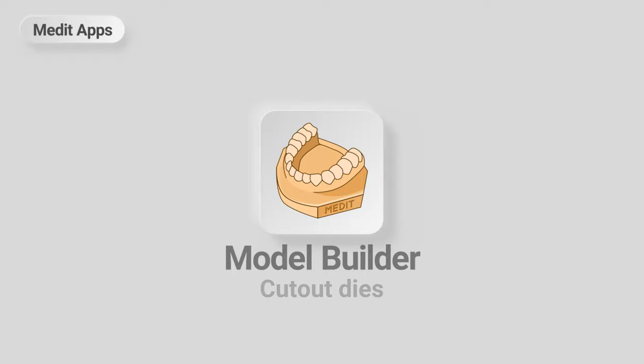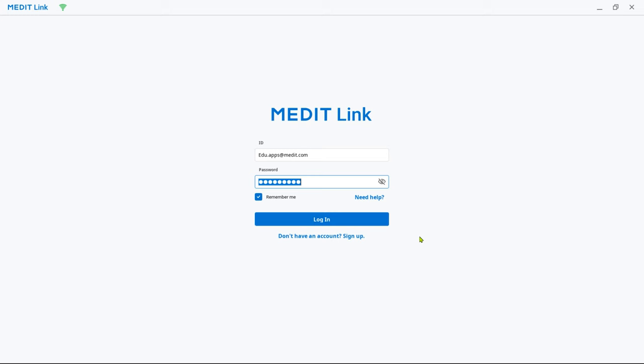This is a quick guide on how to design a model with detachable dies using the Model Builder app. First, let's install the app.